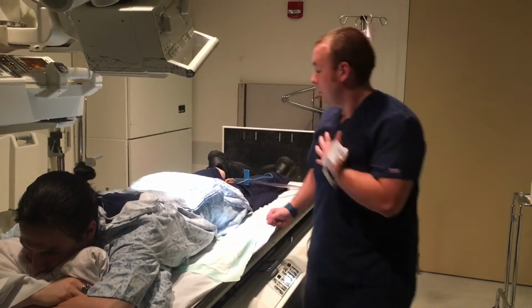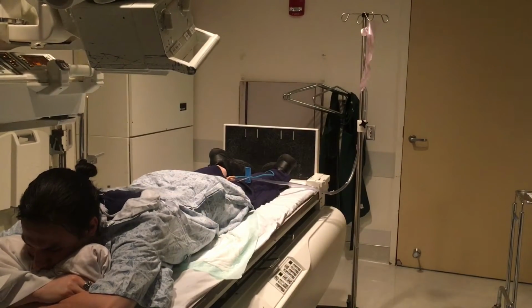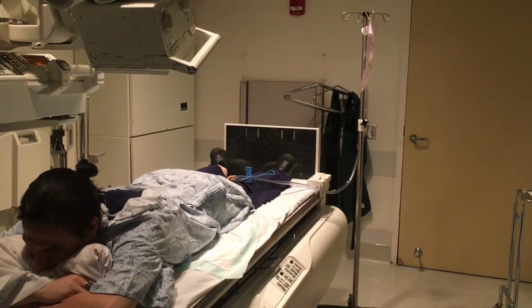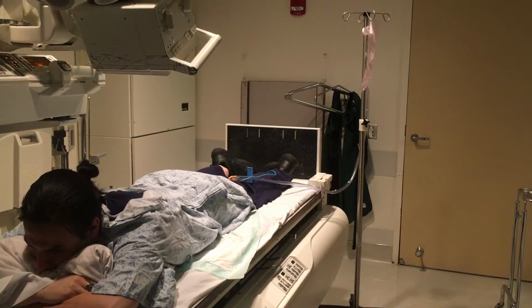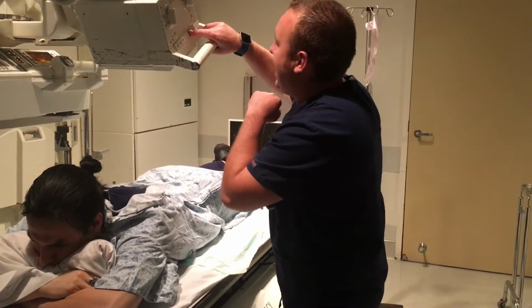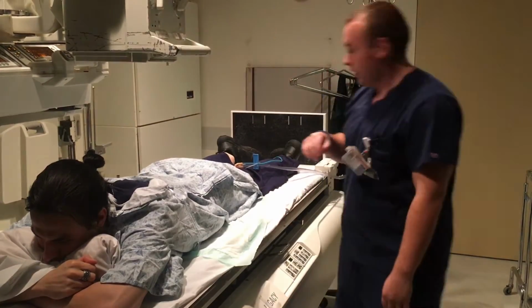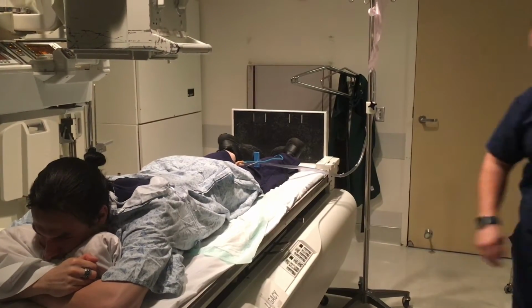Alright. Looks good. Take in a deep breath. Blow out. Hold. X-ray. Breathe. Alright. Just a few more images, sir, and you're going to be out of here. Next, we're going to go for our decubs. We're going to use a grid.